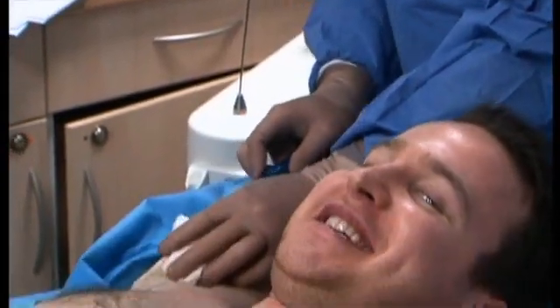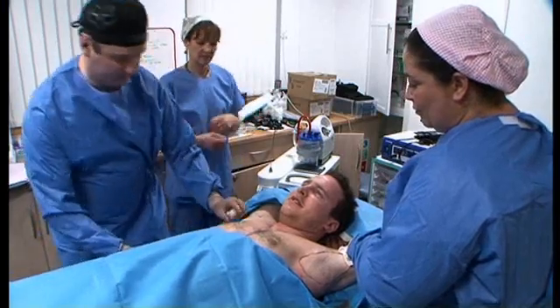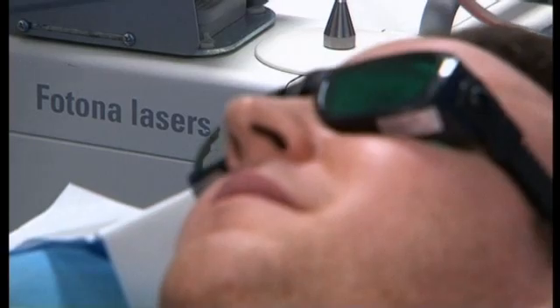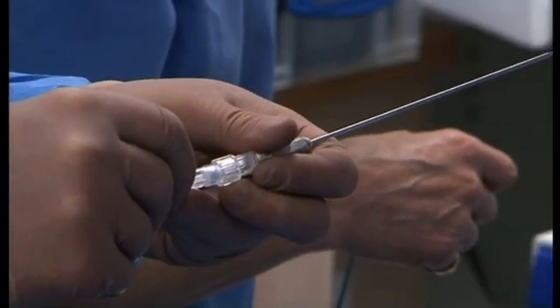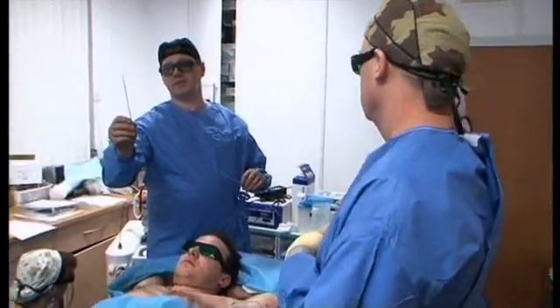You can get some nice pictures now of Richard smiling as we're doing the actual breakdown — this is fantastic. I'd recommend this to anybody. So the laser fibre goes up inside that and it protects it. The power of the laser gets diffracted off the metal at the end and kills the tissue around without boring a hole straight through anything.